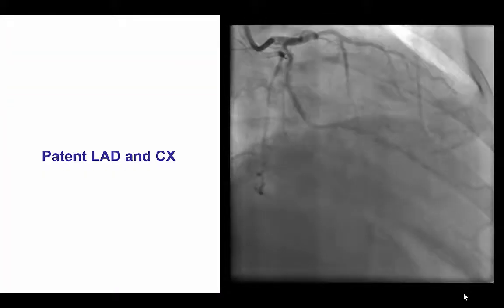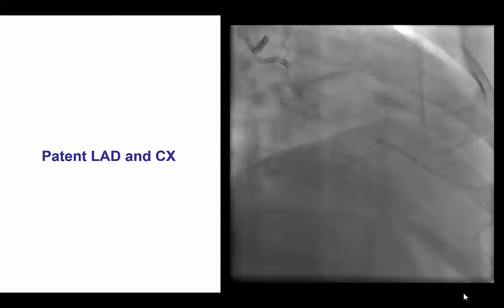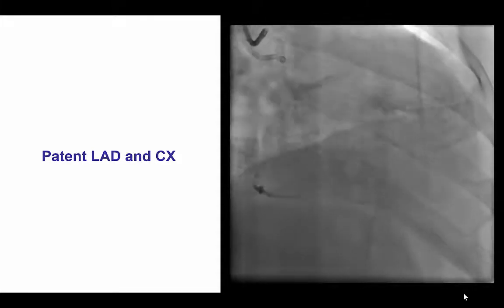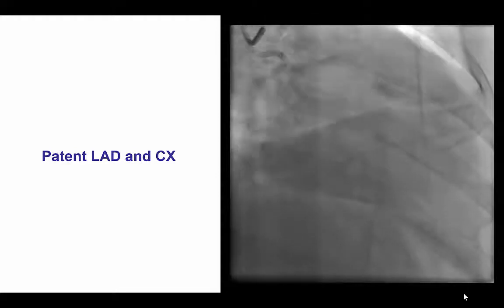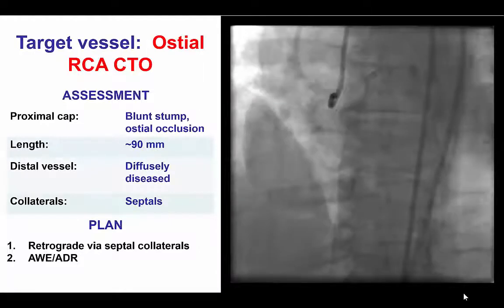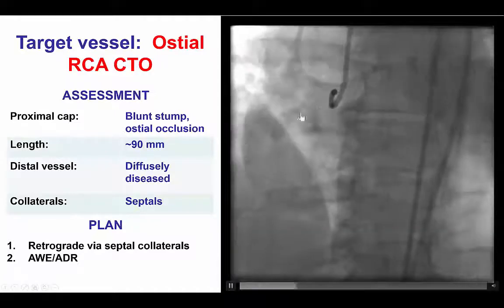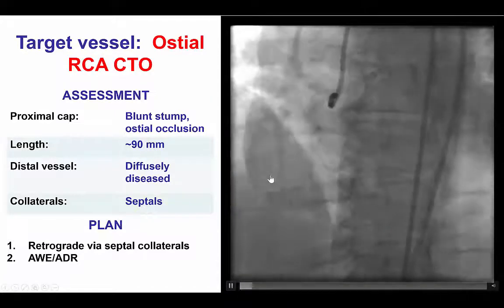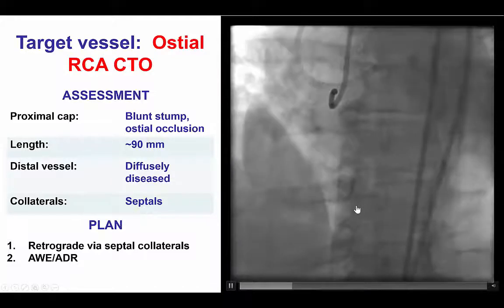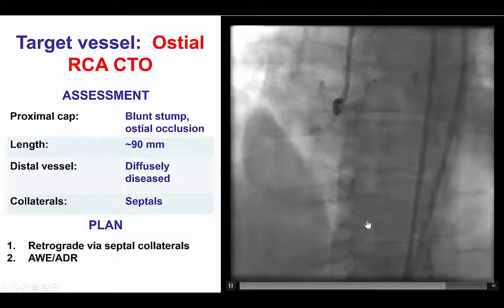This was a patient who had an ostial RCA CTO that had been previously failed. He had patent LAD as well as circumflex vessels, with septal and epicardial collaterals supplying the right coronary artery. The RCA was occluded at its ostium, proximal to a previously placed stent. The occlusion length was long, approximately 90 mm, with a diffusely diseased distal vessel and septal and epicardial collaterals to the distal vessel.